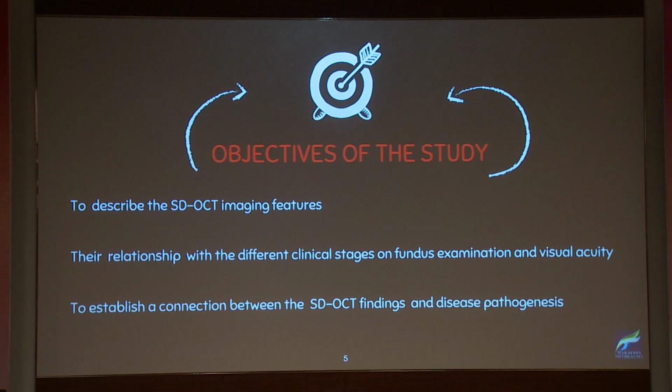The objectives of our study were to describe the SDOCT imaging features of type 2 MacTel, to see the relationship with the different clinical stages on fundus examination and with visual acuity, and to establish a connection between SDOCT findings and disease pathogenesis.